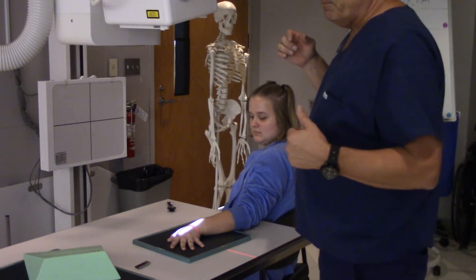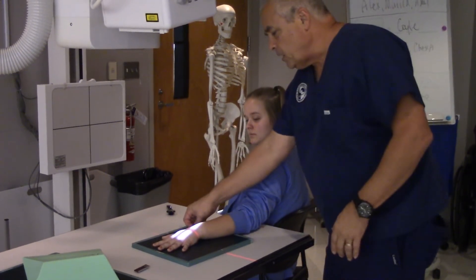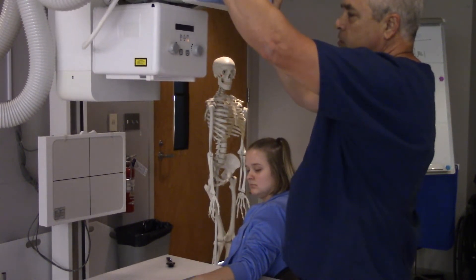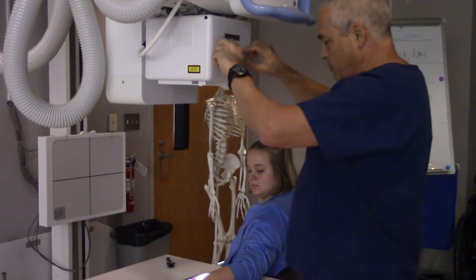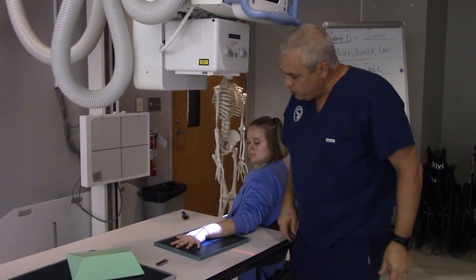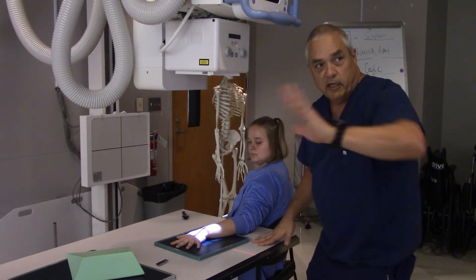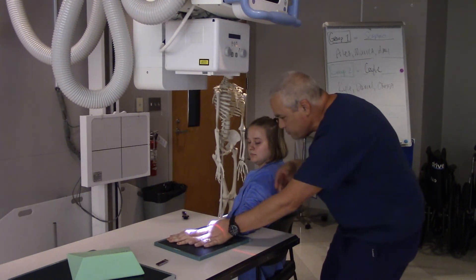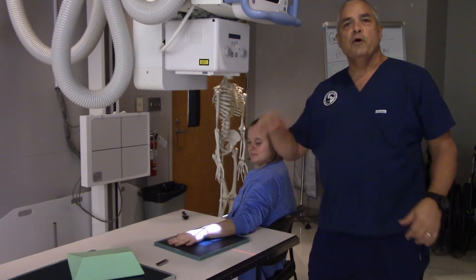I've got one more position to do: radial deviation. This is an image that's not done all that often, but it's really easy. We're going to set up just like a regular wrist x-ray — aiming right here for the mid-carpal area, marker lateral. Then I'm going to get my patient to deviate their hand radially, in other words towards the thumb. There you go — perfect. Patient hold still right there. Beep — done.